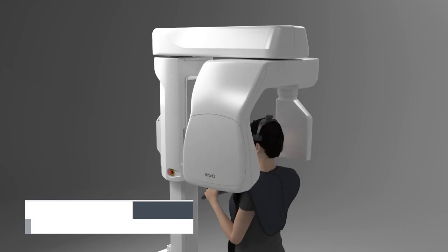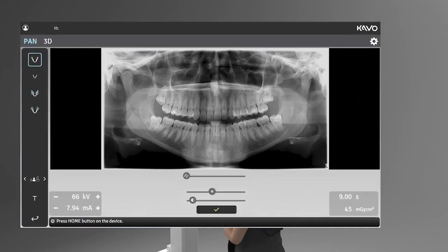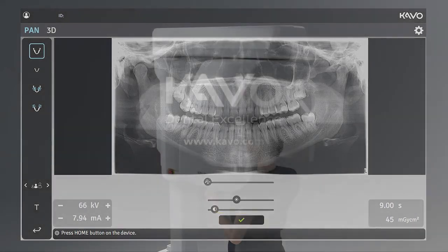The panoramic image will appear on the acquisition workstation. Press the OK button to confirm image acquisition.